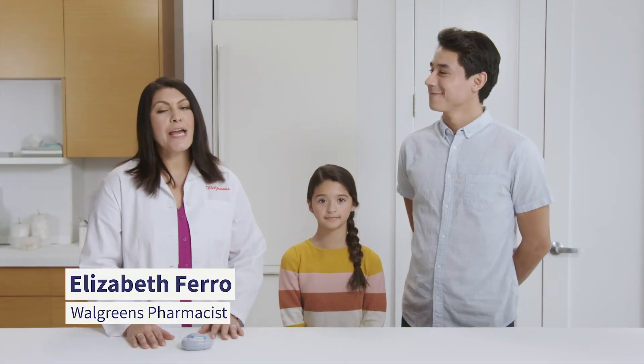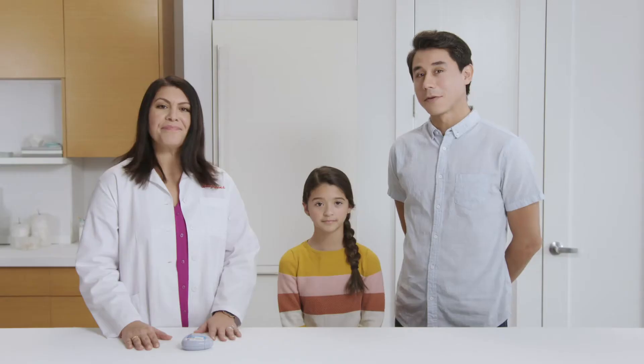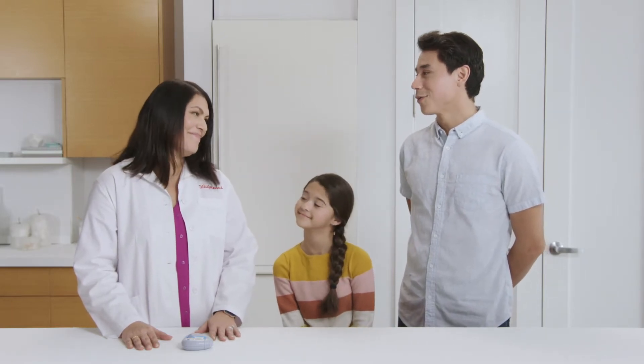Hi, my name is Liz and I'm a Walgreens pharmacist. I see you have a few dry powder inhalers here. Would you like me to show you how to use them? That would be great, especially since she has never used one before. I think we're both a little nervous.